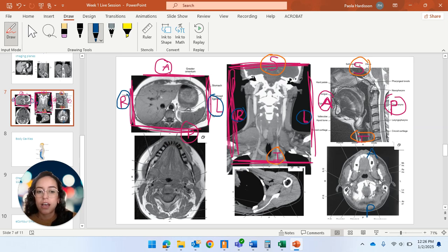Start with that. Here, I can also see the spine. So I know that in this scenario, I'm going to have the ability to either move up or down the spine. I have to kind of get myself visually ready. But localize the spine and use that as a reference point to start off with. And then you have to think in a three-dimensional view, what part of the spine am I looking at? Am I looking at just one vertebrae like this? Here's one vertebrae. Here's one vertebrae available to me. Here's one vertebrae right here.